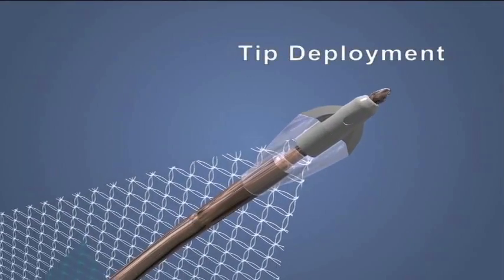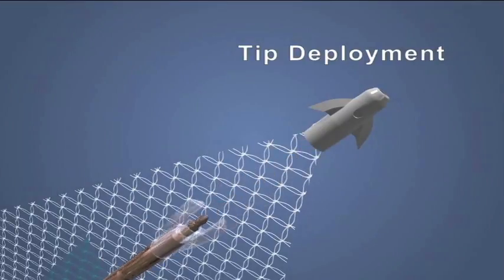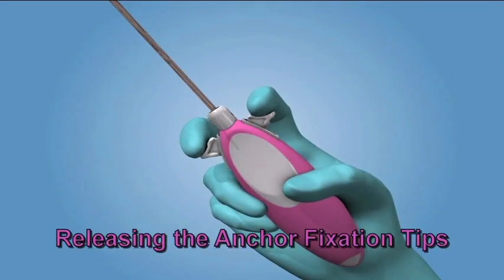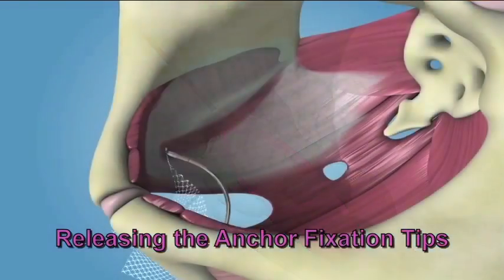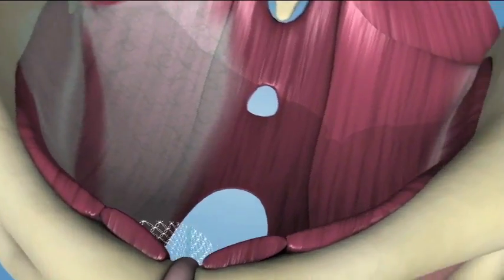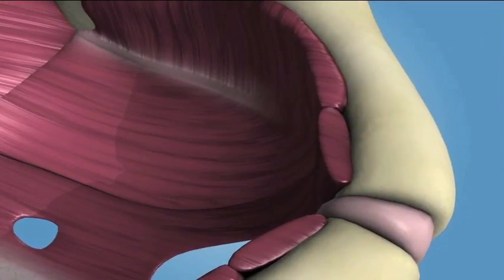Then pivot the handle to ensure the fixation tip approaches perpendicular placement into the obturator internus muscle. Advance the needle until the blue midline marker on the mesh is aligned with the vaginal incision. Once the graft is in position, release the fixation tip by pulling back on the sliders with two fingers of the contralateral hand. Keep the slider depressed while removing the needle. Perform this technique for both patient's right and left sides.